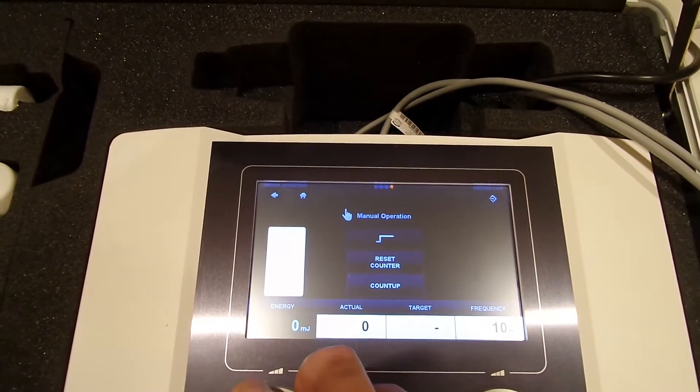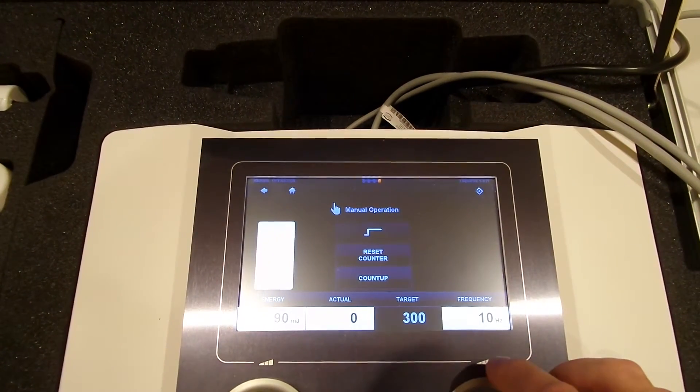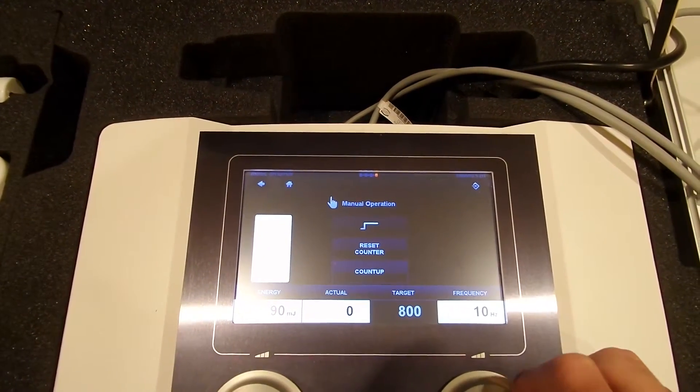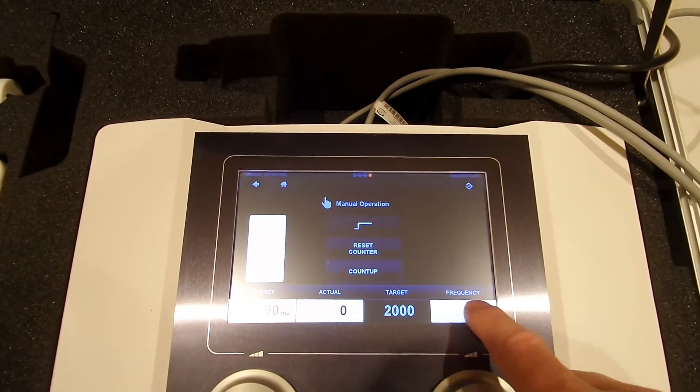We're going to set 90mJ for 2000 shocks at 12Hz.